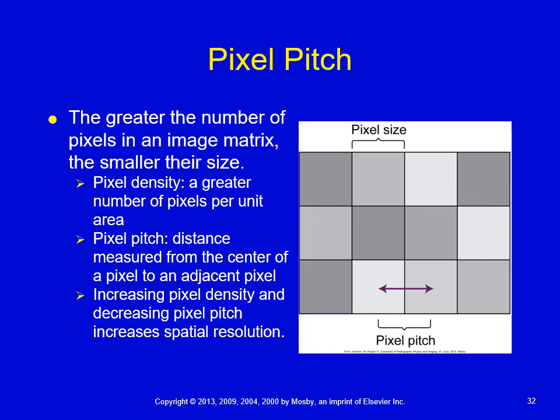All right, so the big takeaway here, outside of getting these terms in your memory bank, is the more pixels that we have, the smaller those pixels have to be, the smaller the pitch or the distance between the pixels, and also the better the spatial resolution.